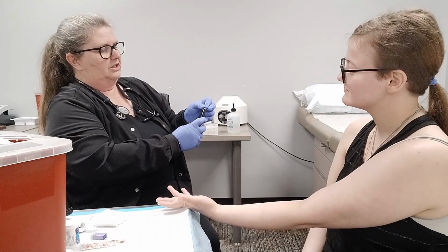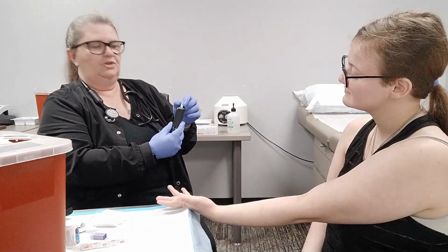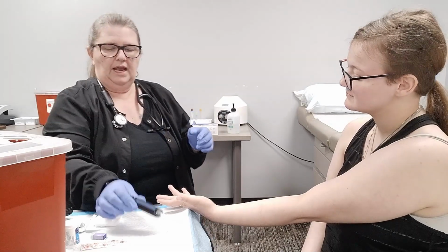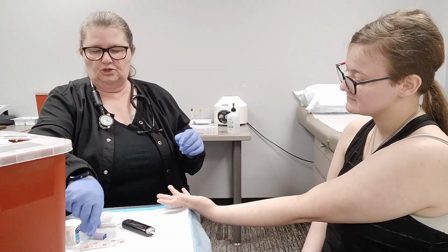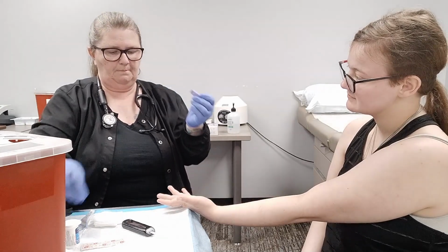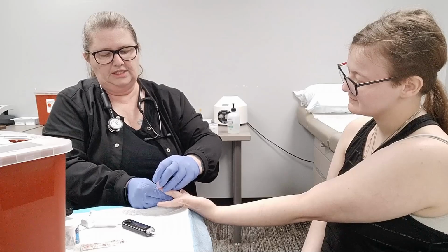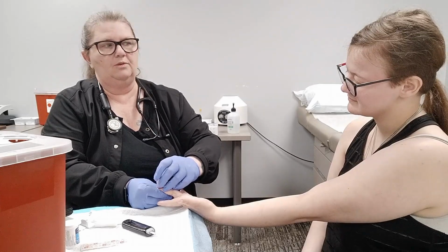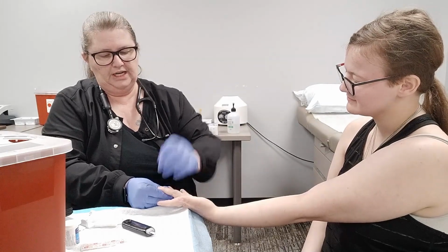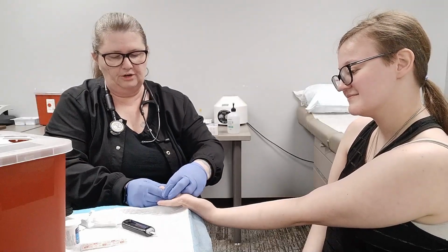So you just stick the strip in. This particular machine, as most machines these days, turns on once you stick the strip in. Then it'll give you a little beep and let you know that it's ready for blood. I'm going to go ahead and uncap the lancet. Hold the finger nice and still, just to the side of the center of the finger, and we're going to do a little countdown so she doesn't jump. One, two, three, little stick. This goes directly into the sharps container.